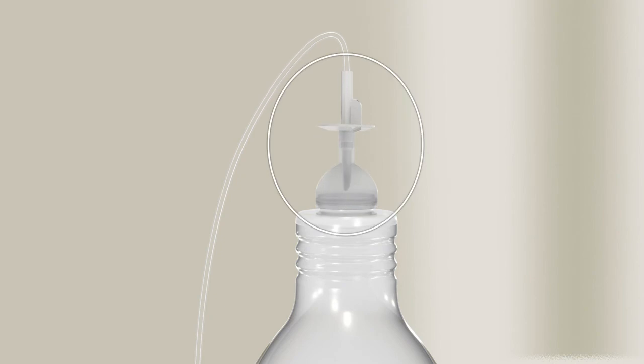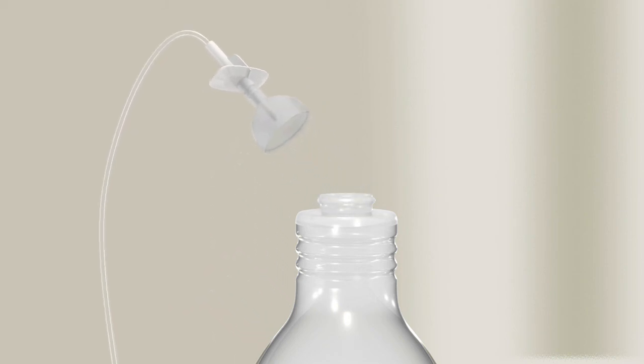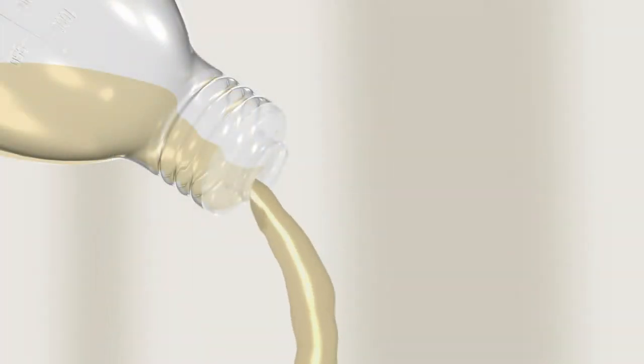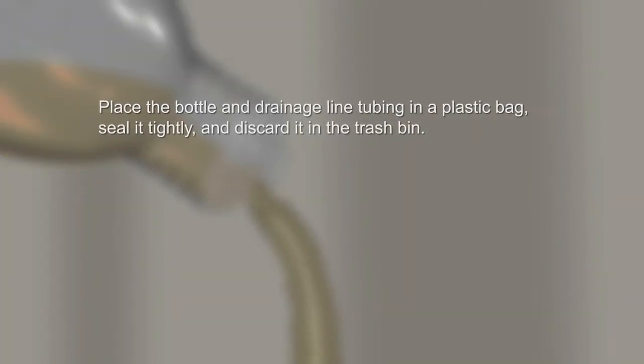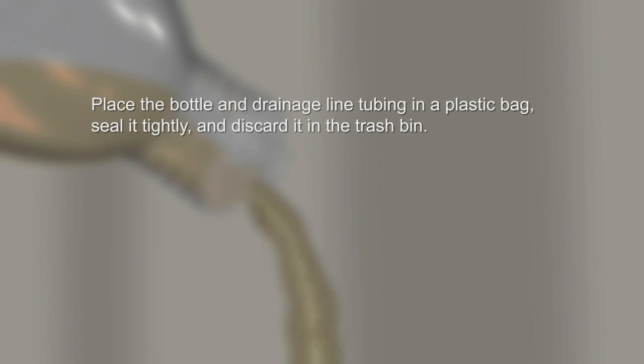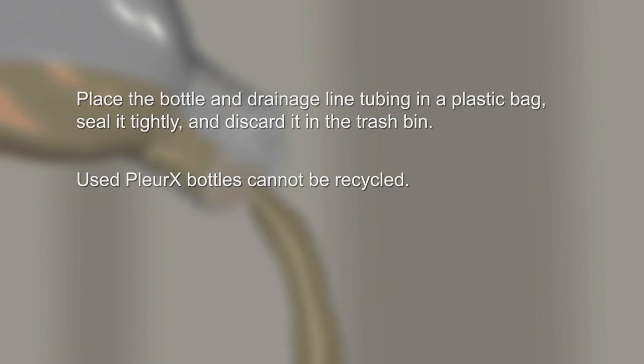To open the bottle, remove the flexible cap with the drainage line attached. Place your thumb on the edge of the cap and push sideways and down into the bottle opening to loosen the cap from the rim. Grasp the cap and pull it away from the bottle top, facing away from you to avoid any splashing. Empty the bottle into the toilet or sink. Then, place the bottle along with the drainage line tubing in a plastic bag, seal it tightly, and discard it in the trash bin. Used PleurX bottles cannot be recycled.